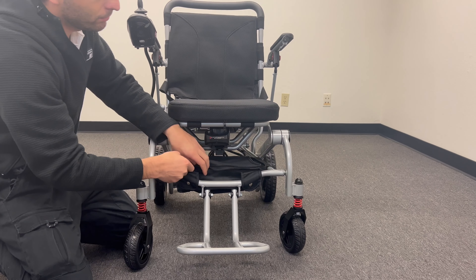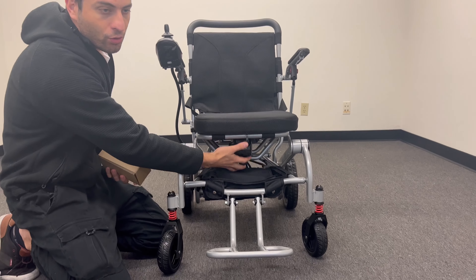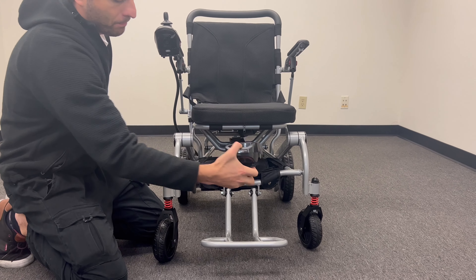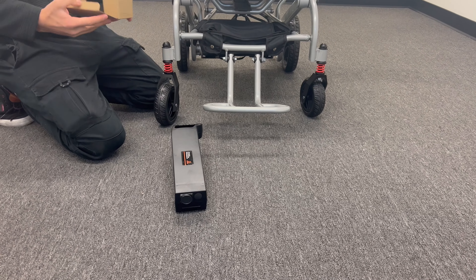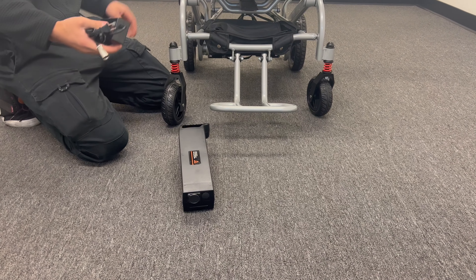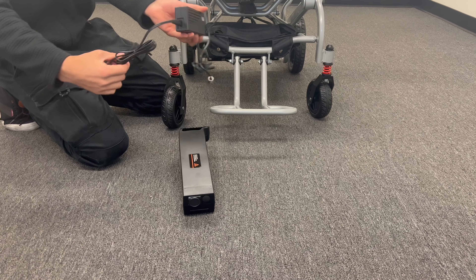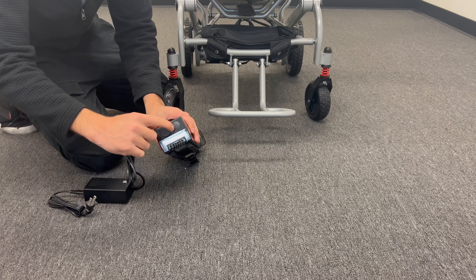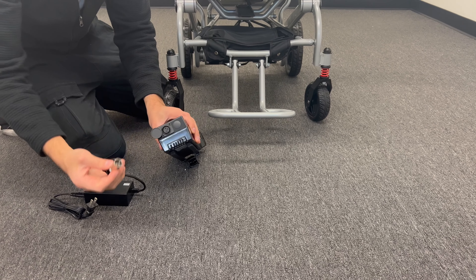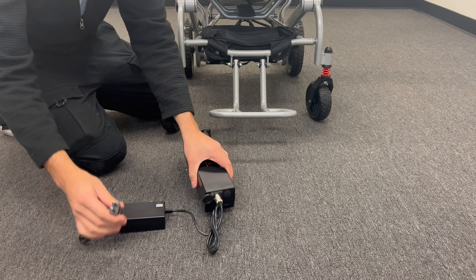The last thing also — we want to show you how to charge the battery directly. This is our battery. As you can see, there is a black spot — you just open it and you see the pins. Put the charger connector in there and then you can charge your battery.